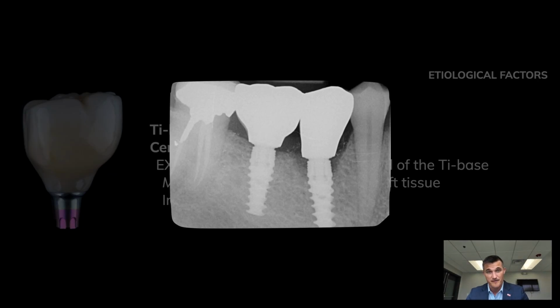Some of them are stable, some of them have a higher likelihood of severe bone loss. How could this have been improved? A longer abutment would have been great. A customized abutment would have been great, but one of those two plans would have been much better than invading those crestal tissues. So that's the R in PROS concepts.